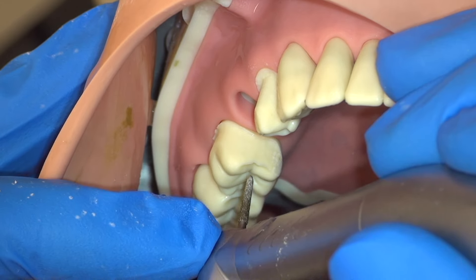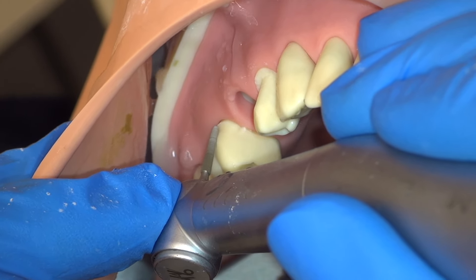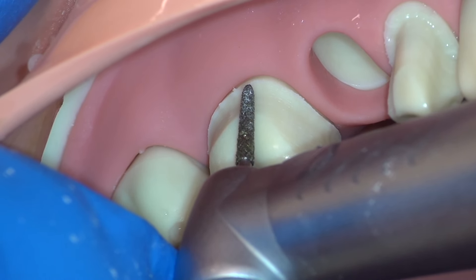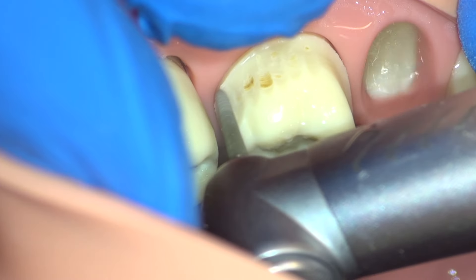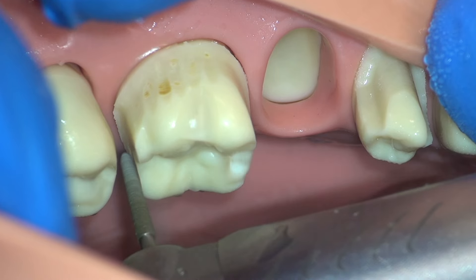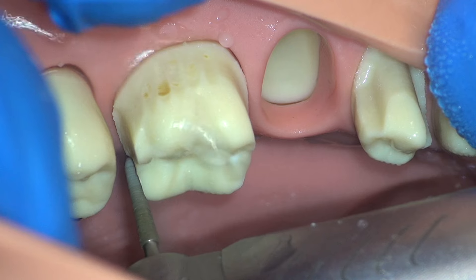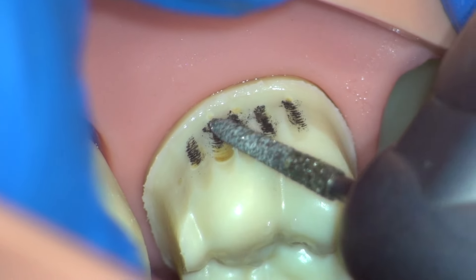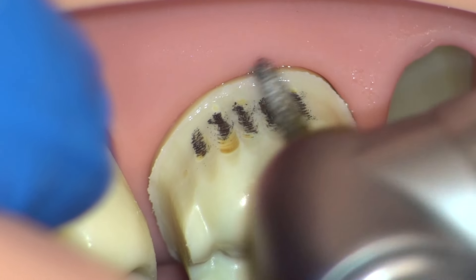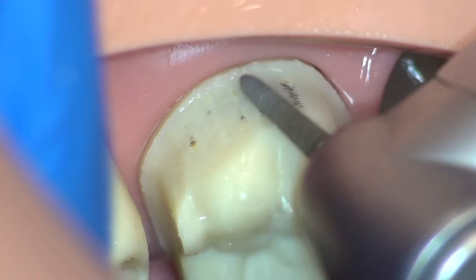For the buccal axial reduction of the molar, consider both teeth again. In this case, I will use depth grooves for the molar. After selecting my angulation carefully, I make one depth groove in the molar and then use this depth groove to regain my angulation. You can use a mechanical pencil to mark the depth of your depth grooves so that you can see when you have reached that depth as the pencil starts to be removed. Angle your bur diagonally to the depth grooves to avoid falling into them and deepening them, but rather smoothing out the bumps in between. As soon as the pencil mark has been removed, you know that you have reached the final depth and no more reduction is required. Smoothing will be finished with the red diamond bur at a later step.